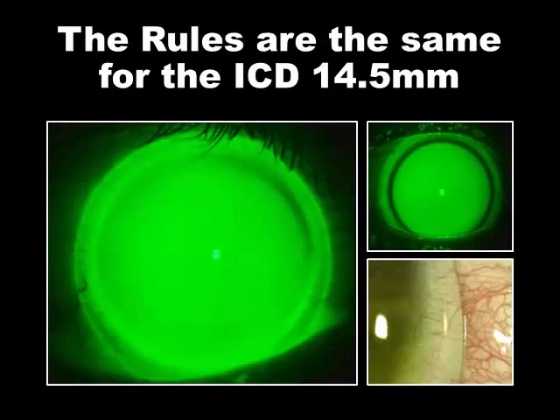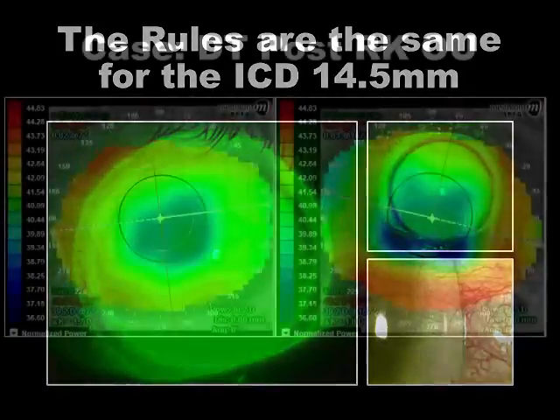So with the ICD 14.5, consider apical clearance, having good vault through the central cornea. If you have a wide area of peripheral corneal alignment or touch, then you need to increase the limbal clearance zone. If you see any blanching, you need to increase the edge lift. So scleral landing zone -1 or -2, maybe even -3 if it were a severe case.